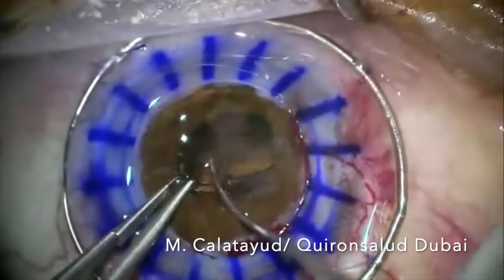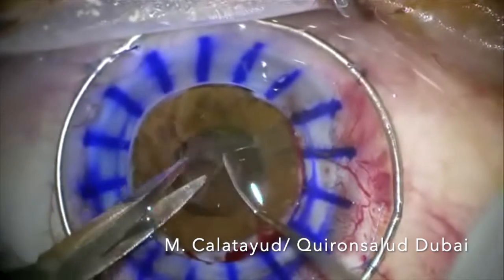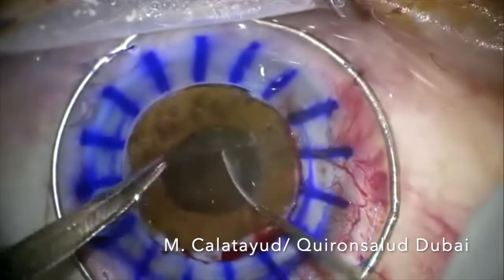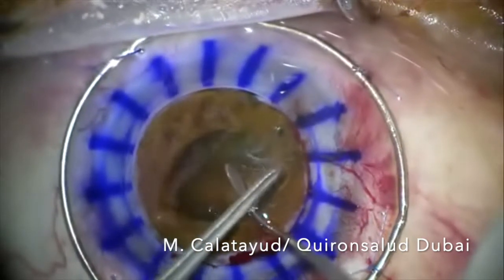After implanting the lens, it is very important to remove all the anterior capsule remnants, so we have to complete the capsulotomy to avoid any clouding in the visual axis.